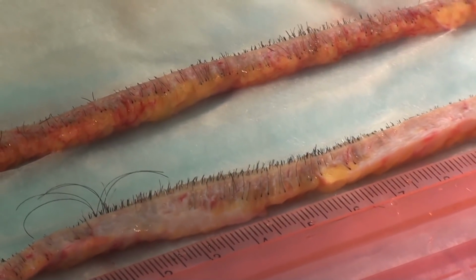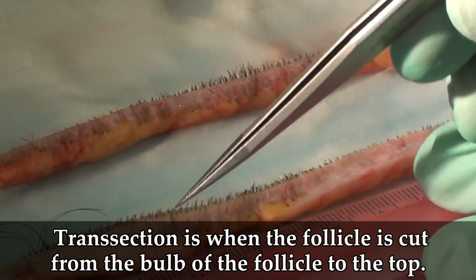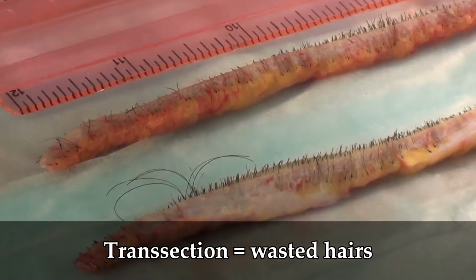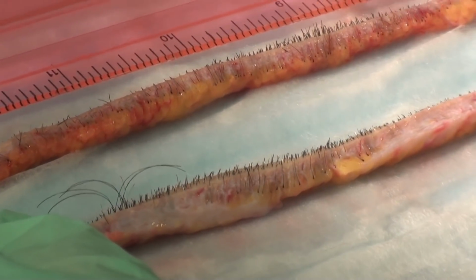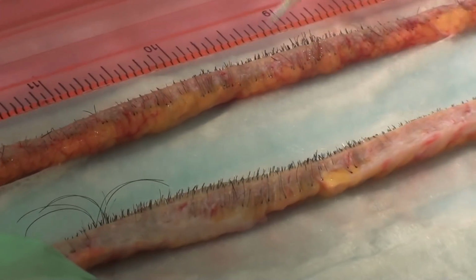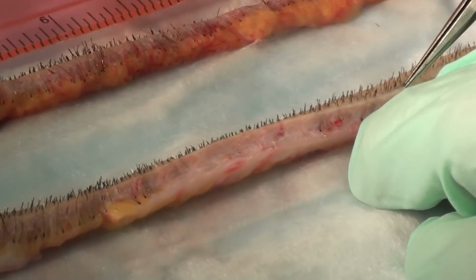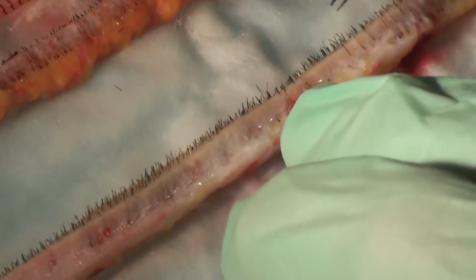What's very important about the donor tissue is when you're harvesting it, you want to minimize any and all transection. Transection is when a follicle is cut from the bulb of the follicle to the top where it comes out at the surface of the skin. So by minimizing the transection, we maximize the overall amount of hair by increasing the overall yield. So even with this scar in place, let's take a look at how we did here. It's nice and clean. You can see all these hairs are nice and intact, where the bulb goes from the bottom to the hair follicle all the way out to the skin. Everything's nice and clean and intact. Now when we go through the scar, you can see once again very little transection because there's no hairs in the scar, so everything's nice and clean the whole way through.